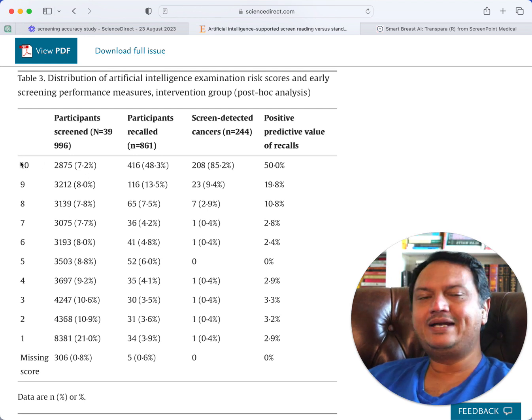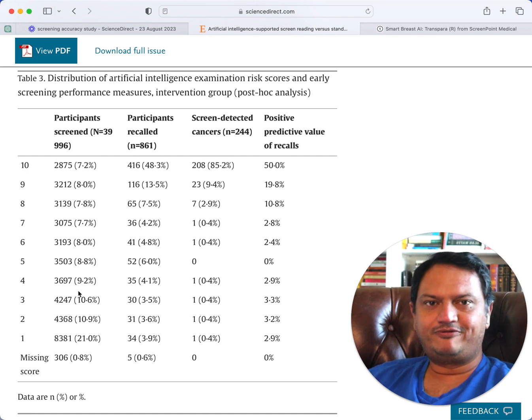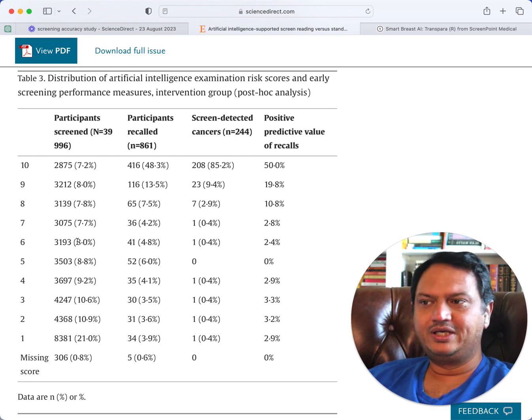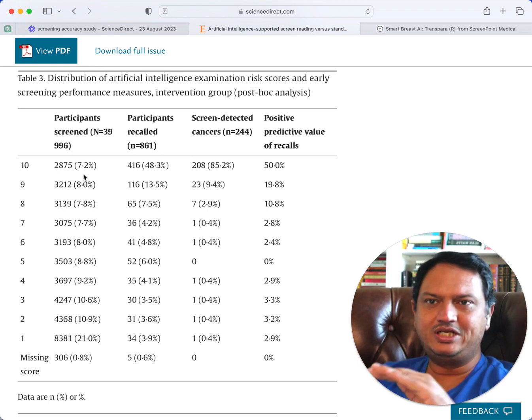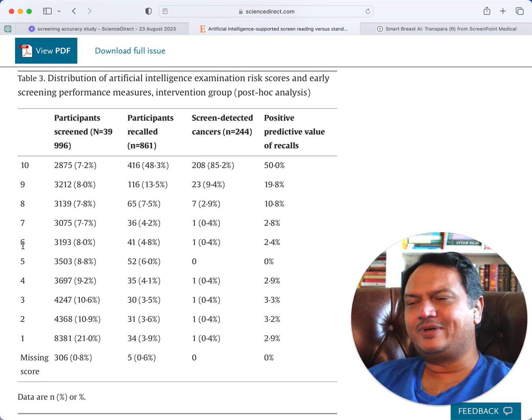If you keep dividing people into 10 almost equal components or segments by design of your software, then you will always end up, just statistically, with a lot of people in group 10, right? If it's going to be a tenth of the persons that you're screening as the top 10 score, then I'm puzzled by it. This should not be the way, right?